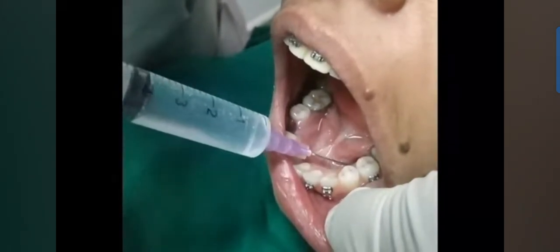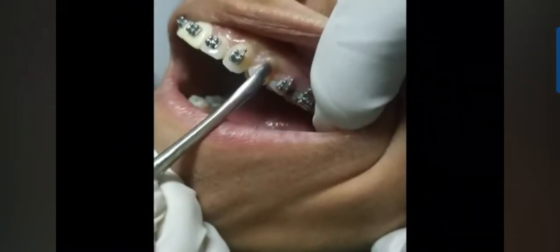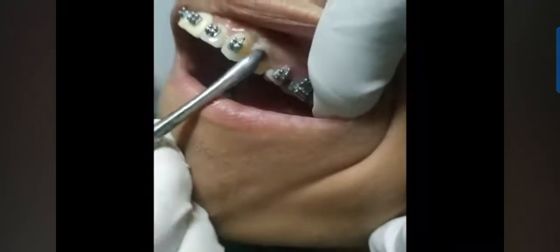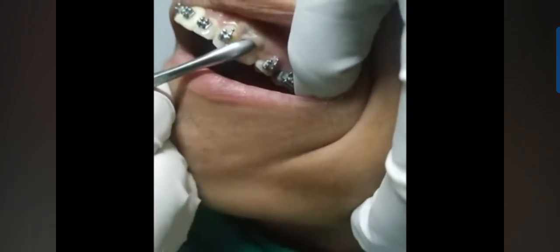So this is a case of orthodontic tooth extraction. Now we take a periosteal elevator and we are going to retract the gingiva. Whenever you retract the gingiva, retract from the mesial, labial and then distal region. Make sure that the papilla is not torn and the gingiva is not torn.